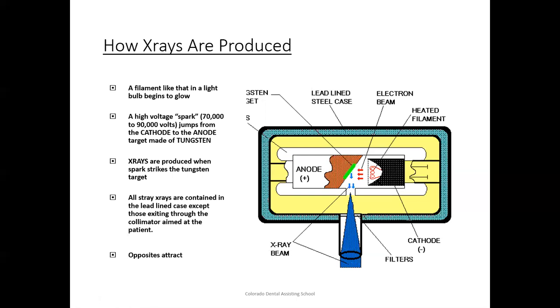You never want to step over the cord when you're leaving the room. Please go out of the side that you've entered and do not cross over the cord. If we see you crossing over the cord and you trip on it and break the sensor, you will be disqualified from the radiology exam, and there will be a fee for breaking it.